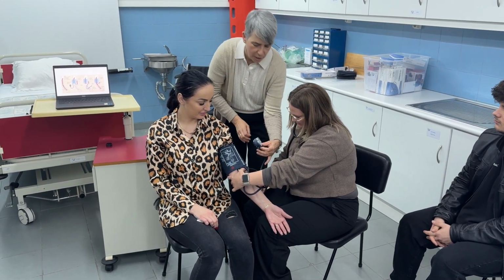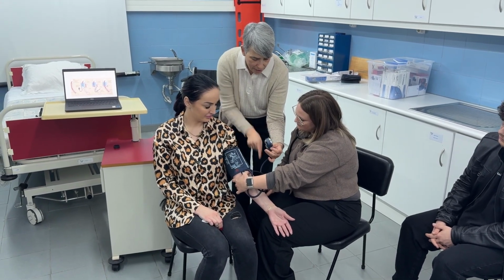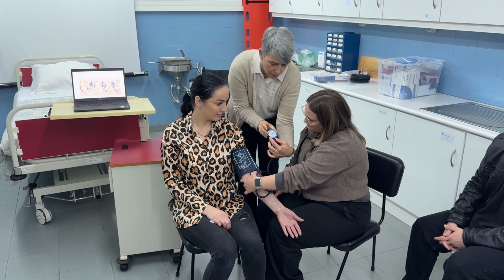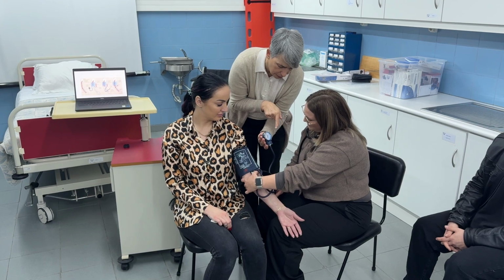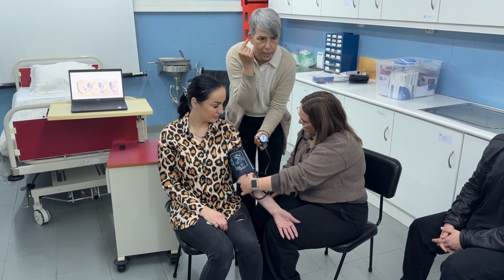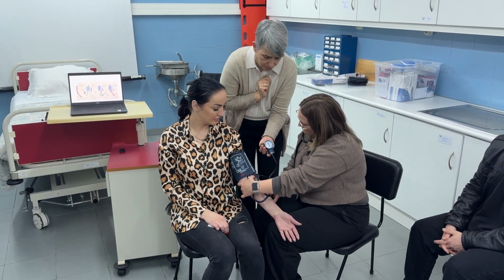So she has done it to 200 millimeters quickly. Then she will open this balloon with one hand, and you see the pressure going down. This is too quick. And then at a certain moment you will hear a tock. That's the moment the blood passes again.